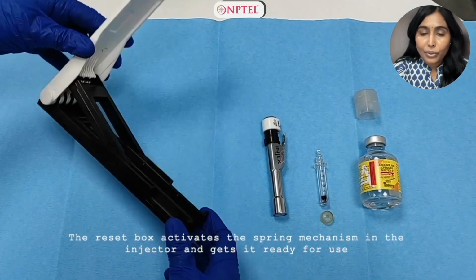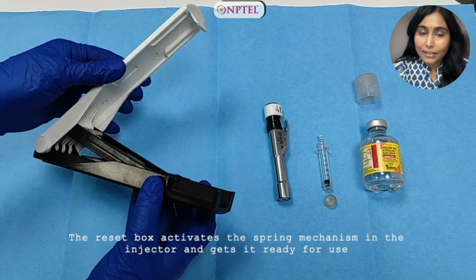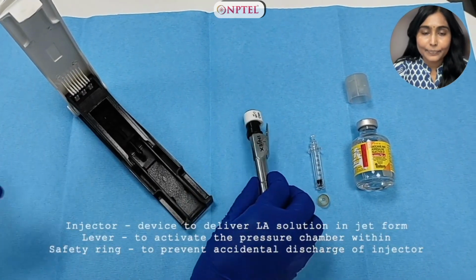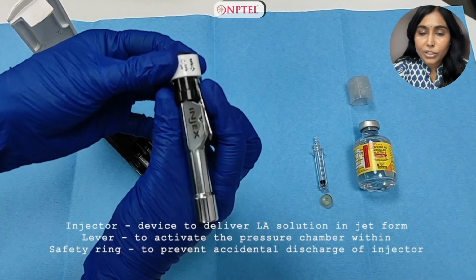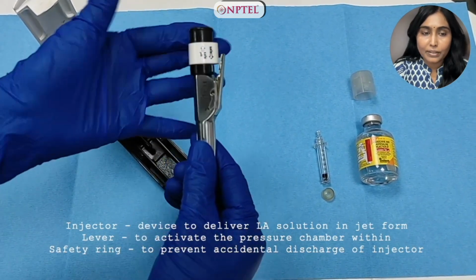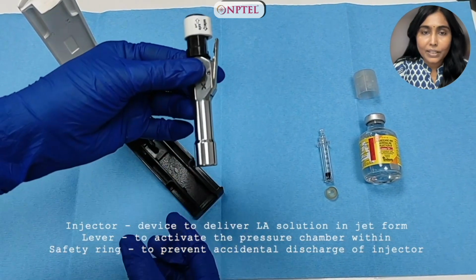Now this is a reset box which is used to activate the spring mechanism in the injector and gets it ready for use. This is how you activate with the injector inside. This is the injector which is used to deliver the solution in jet form. That's a lever to activate the pressure chamber within. This is the safety ring to prevent accidental discharge of the injector.